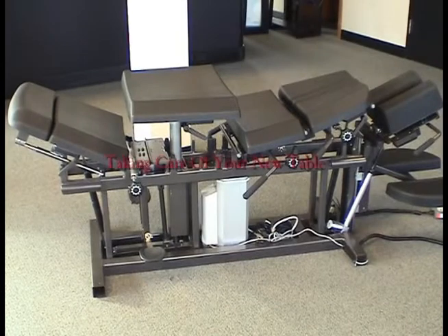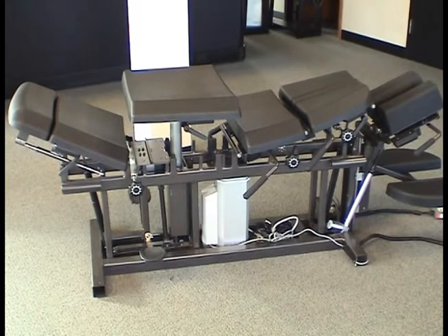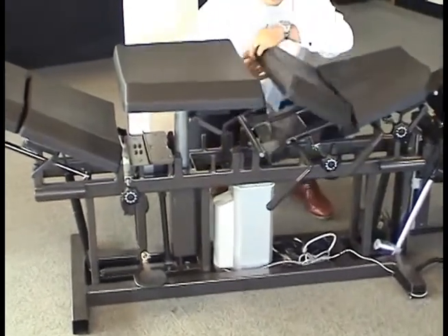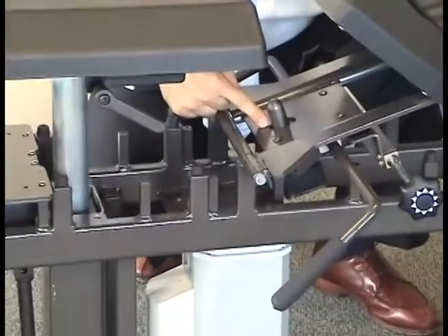Taking care of your PCT table. The polyurethane pads should be washed with mild soap and water. Rinse any remaining soap residue off with clear water. Periodically, the drop mechanism pins should be greased.